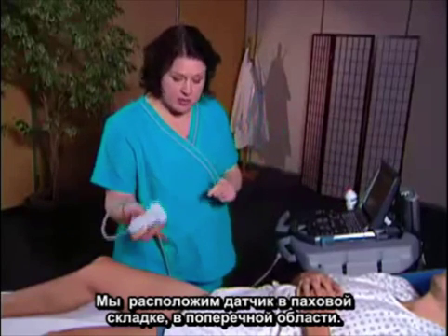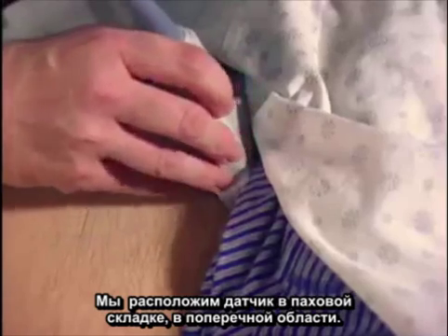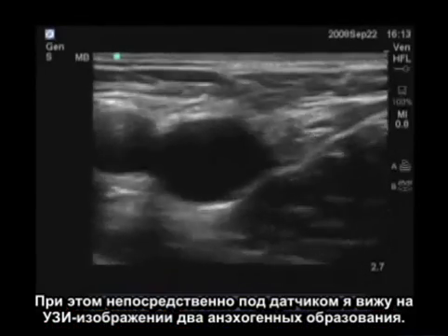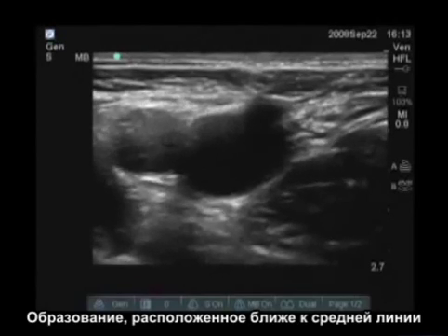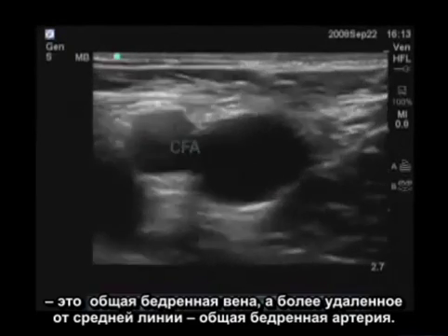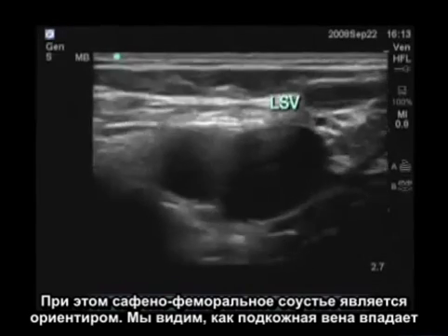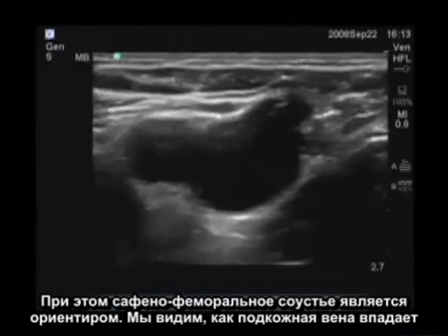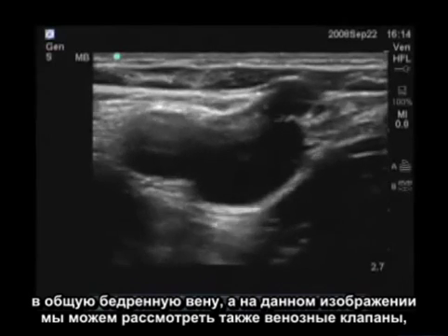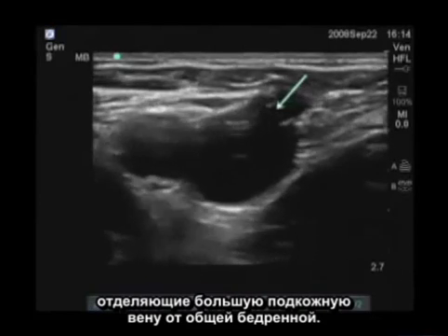We're going to place the ultrasound transducer at the inguinal crease in a transverse view. Immediately below the transducer in the ultrasound image, I'm going to see two anechoic structures. The one that's more medial is the common femoral vein, and the one that's more lateral is the common femoral artery. The way I can landmark this is by looking for the junction with the long saphenous vein, which we see emptying into the anterior aspect of the common femoral vein. In this image, we can actually see the venous valves separating the long saphenous and common femoral veins.